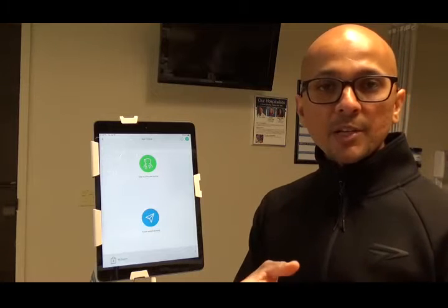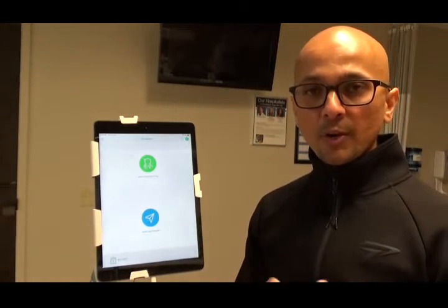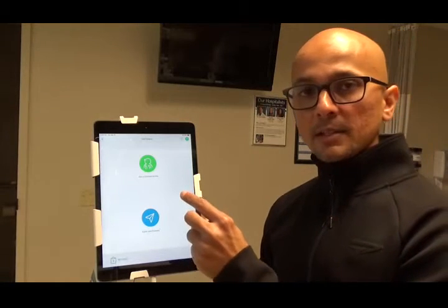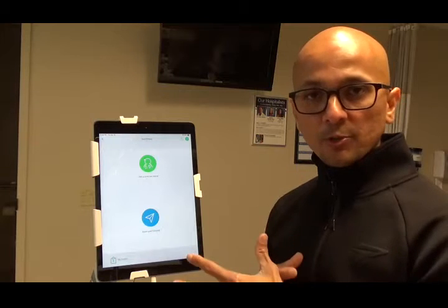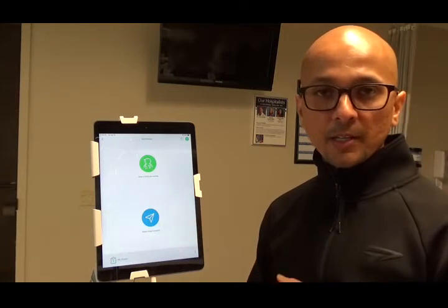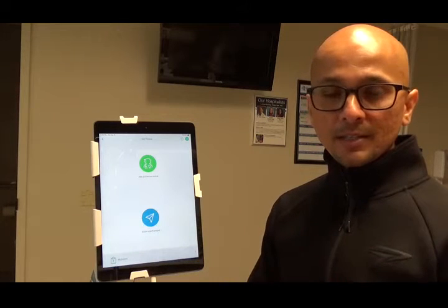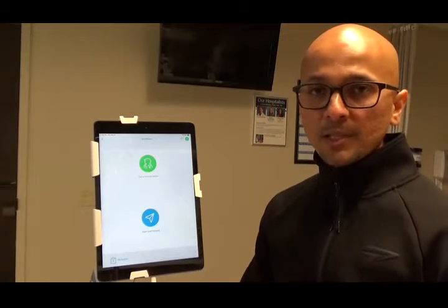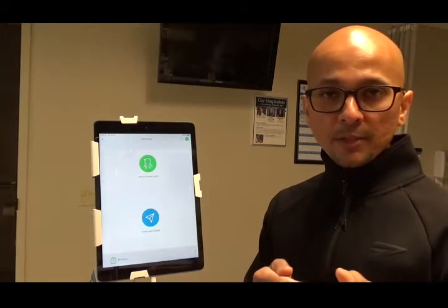So that's that part. The examine forward is, let's assume that someone told you about an inpatient consult that was done for cardiology. From a nursing standpoint, you could go ahead and do examine forward, record all the physical exam, which I'll show you, and then you forward it to the cardiology department. So this way, when they actually do the telemedicine encounter maybe 30 minutes or an hour later, the physical exam's already done, and they just focus on the interview part.